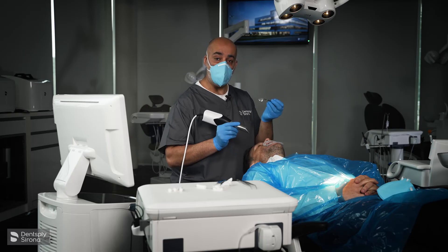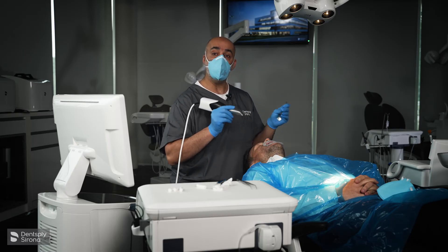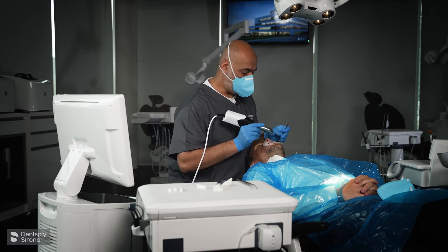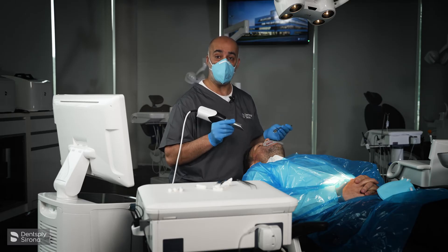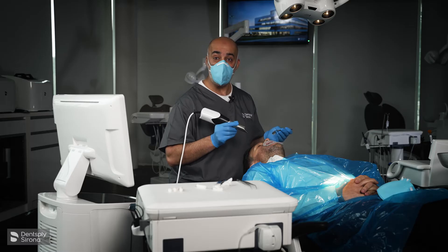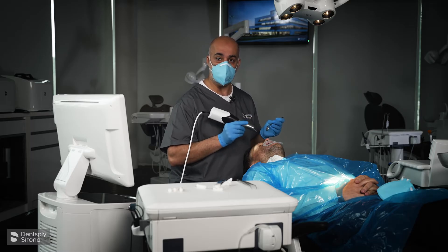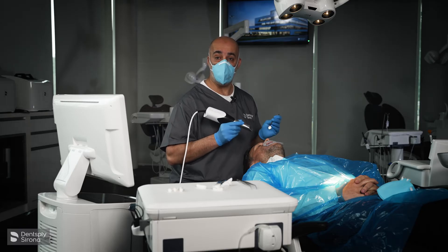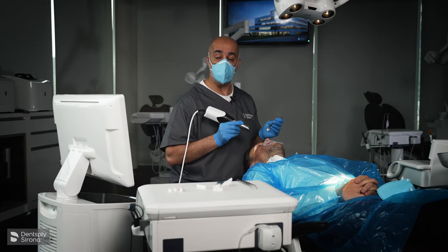I'm using the mirror because we've got wisdom teeth in this patient, so we need to move the tissues out of the way. You'll start to capture as soon as you put the camera in — it will start to capture the image of the teeth. You'll start around the premolar-molar region because that's where it'll start to capture. We'll keep it about two to three millimeters off the occlusal surface and let the dynamic lens do all the work.